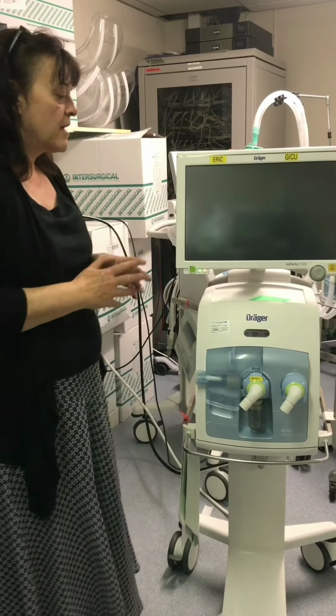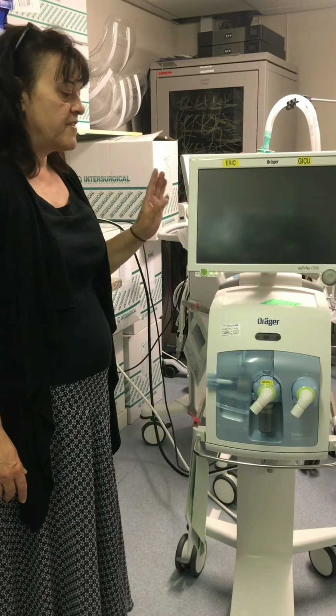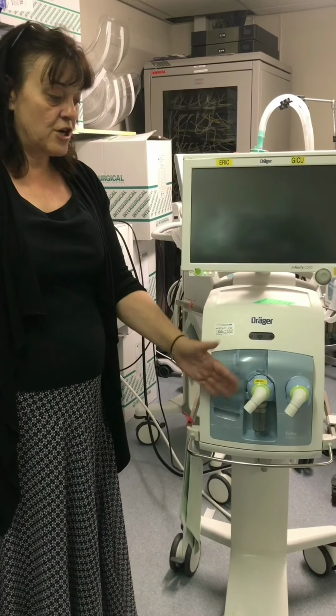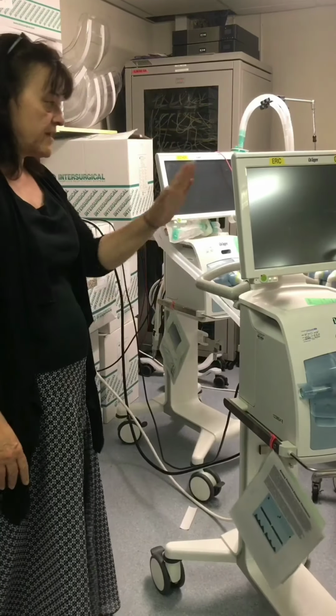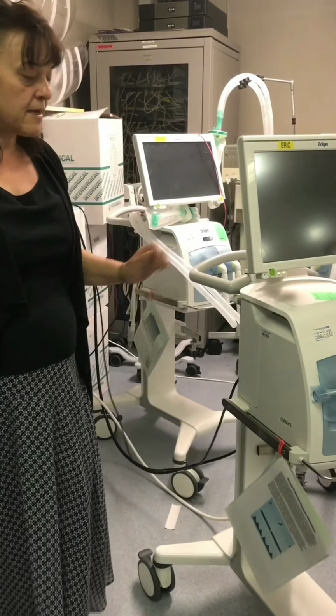Okay, I'm going to now show you how to do a pre-op check on a V300, V500. The other video showed the expiratory valve. So we're going to connect our ventilator to the mains and oxygen and air, which is at the back.